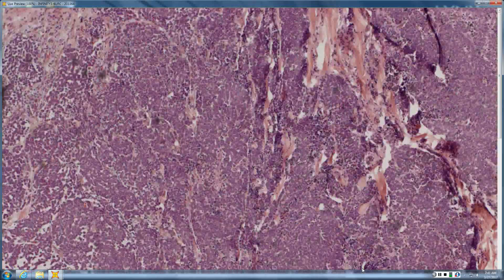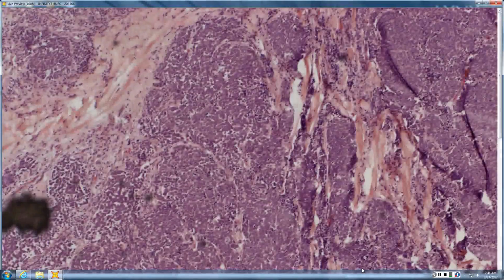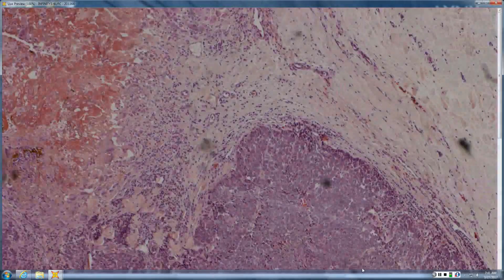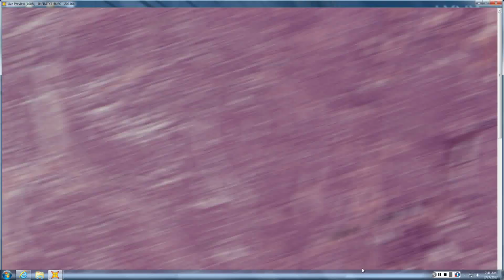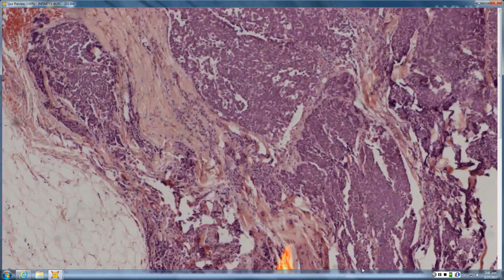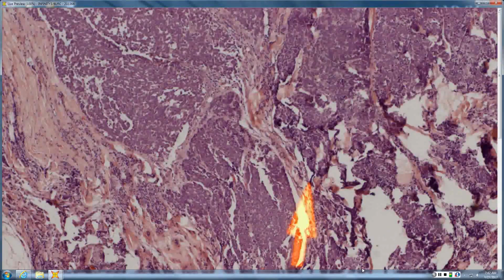Okay, so we're on the scalp. And then is this goodness or badness on the scalp? Pretty ugly. So tell me. Small round blue cell tumor. Go ahead. Kind of like trabeculae. And it has a trabecular growth pattern, which is the same as what in melanoma we'd call a parallel theque pattern, which are just these long parallel nests.